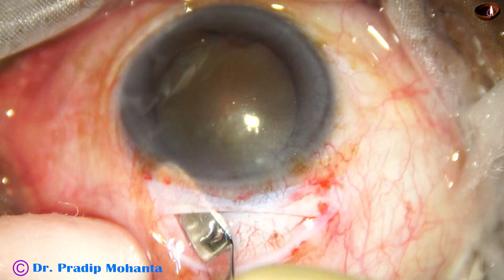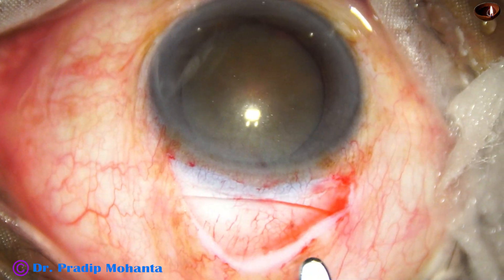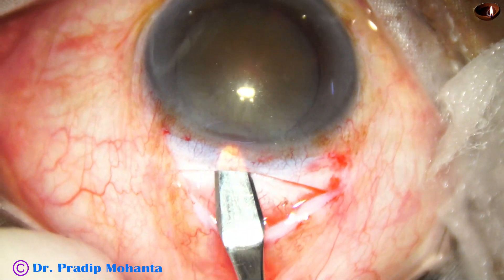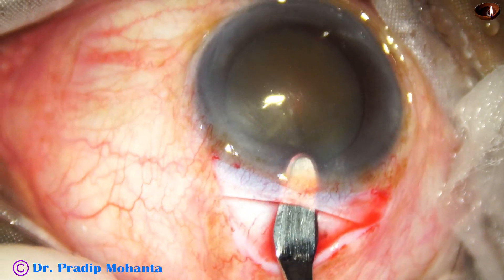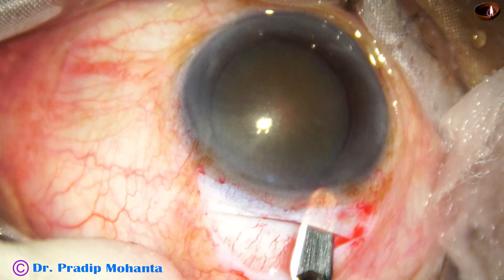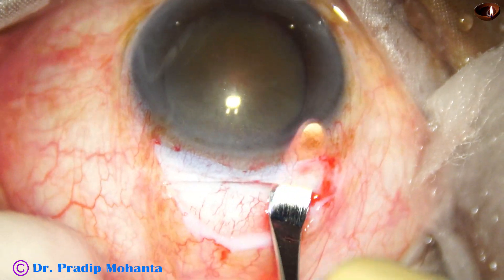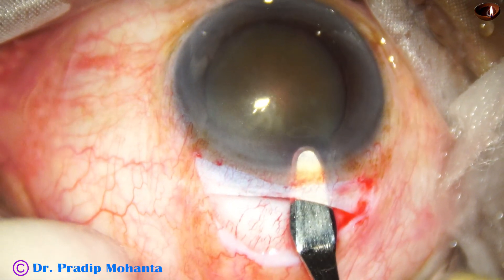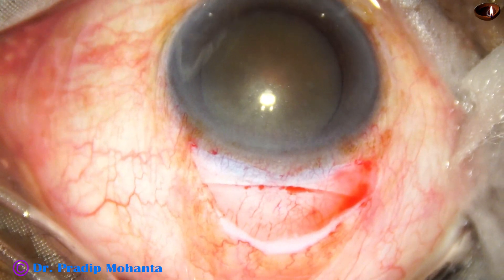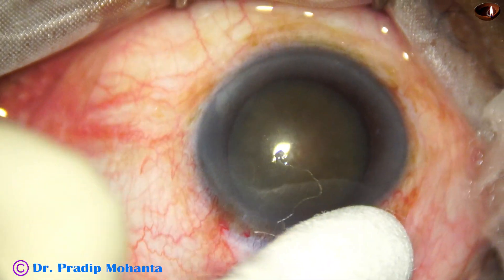Once this incision is made, the sclerocorneal tunnel is started. You must do the sclerocorneal tunnel in such a way that the inner opening is about 2 millimeters more than the opening on the sclera — that is, the opening in the cornea is wider than the opening in the sclera. This helps in engagement of the nucleus in the sclerocorneal tunnel. When doing the dissection on the sides, we have to follow the contour of the eyeball; otherwise we may just cut the scleral flap.